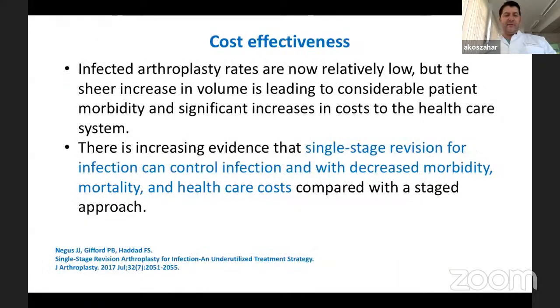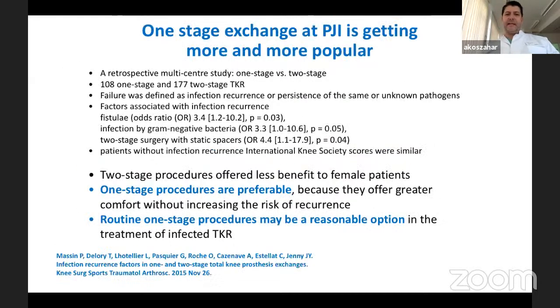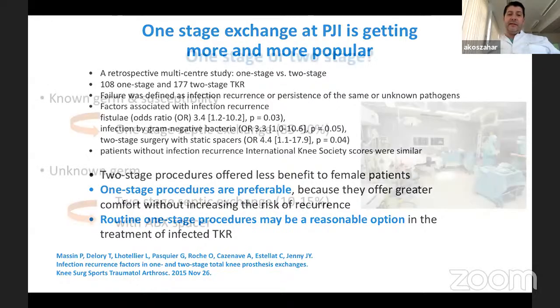It is also cost effective. Of course, one surgery is cheaper than two surgeries. And it's getting more and more popular worldwide. It was only the Endo Clinic and some other hospitals, Wrightington Hospital, and some centers also in India and France, in Paris, to go for one stage. But now it's getting more and more, and even in the United States, there are more surgeons starting with one stage because they see it's reasonable, it's cost effective, patients like it, surgeons like it, and of course you have some possibilities to do so.